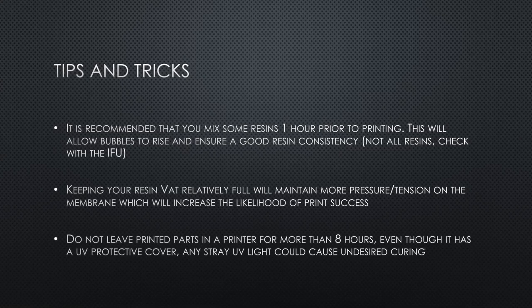And also, don't leave your printed parts in a printer for more than 8 hours. Even though it has a UV protective cover, it doesn't filter out all UV, so any stray UV light could cause undesired curing. If you're leaving the printer overnight, there's no light, so turn off the lights inside the lab, and that should help as well and extend that time a little bit.